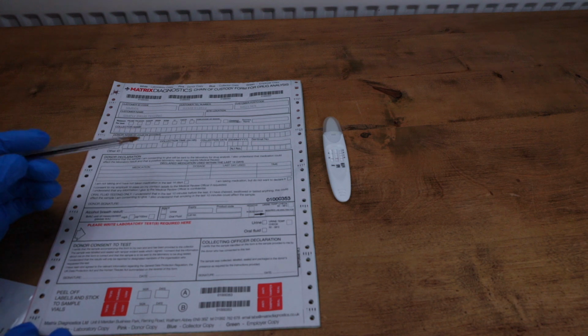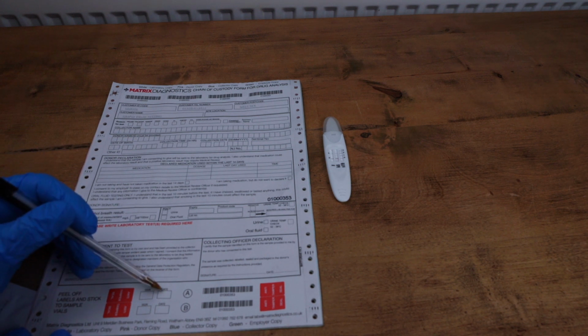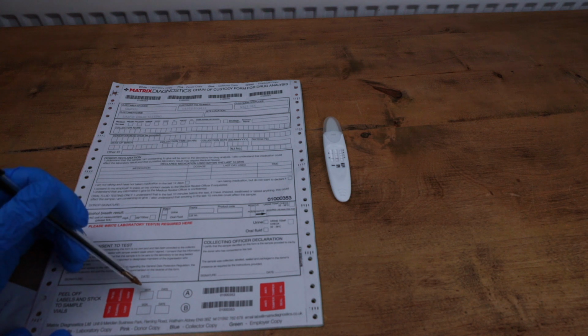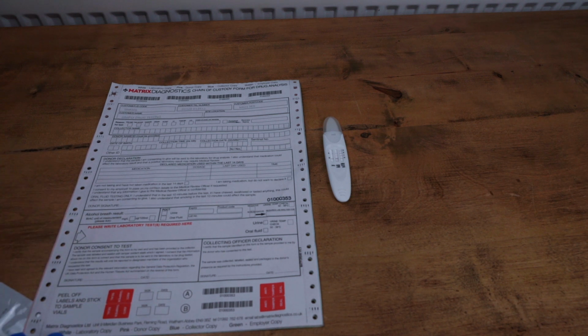And the only thing left for the employee to do now is to sign and initial and date the two what are called anti-tamper seals at the bottom of the page. These are the orange seals. They'll need to have an initial and date in each of those, one marked A and one marked B. That is a complete consent form, and I'm now going to come on to showing you how to conduct the test itself, and with the paperwork sent off to the laboratory.